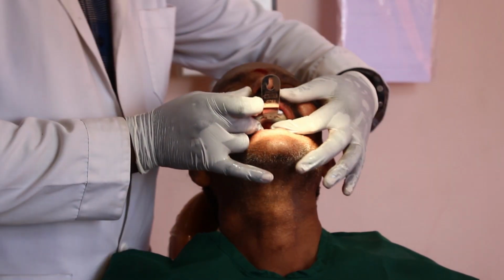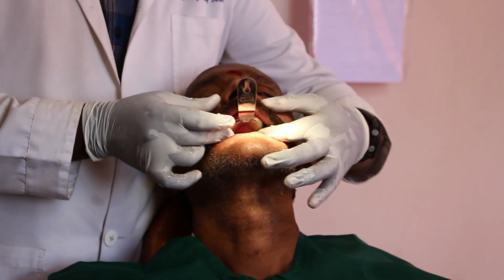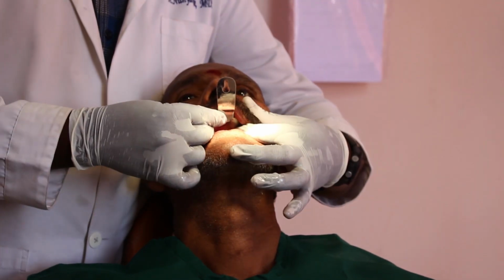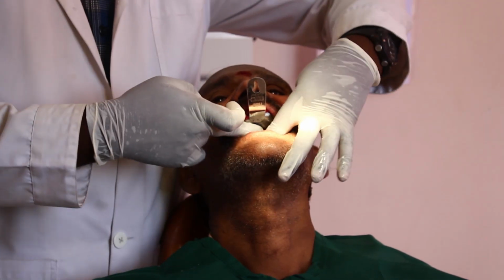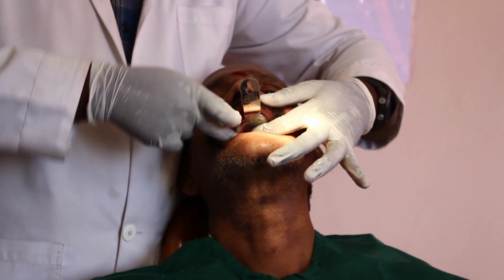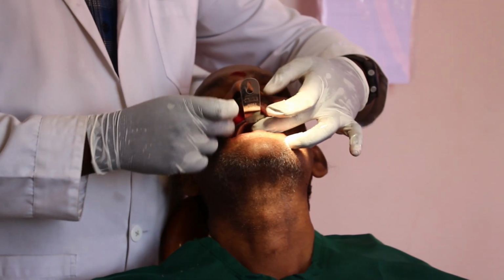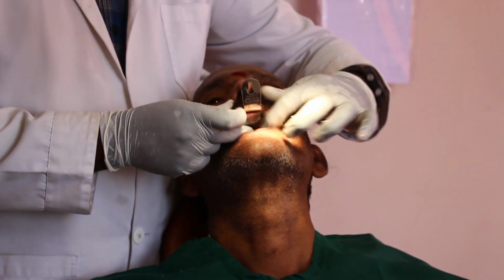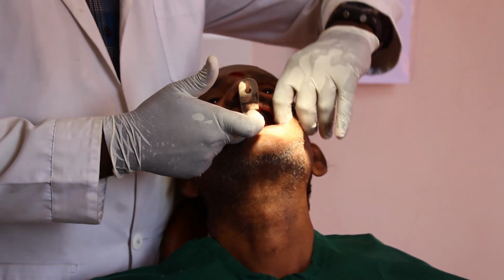During this posture, you can go behind the patient, so it will be comfortable for the operator. After seating it, you have to apply the seating pressure till it reaches the desired vestibular depth. Ask the patient to relax the lips, and then you have to hold the tray with one hand and mold the other side.